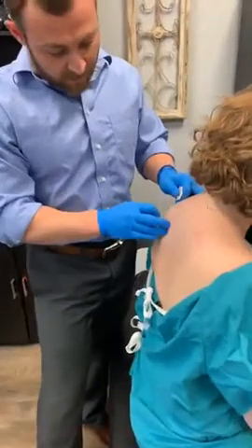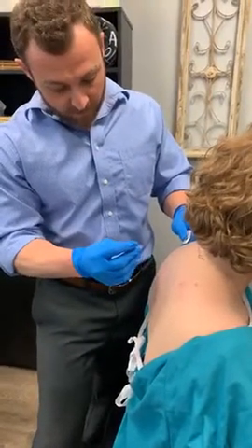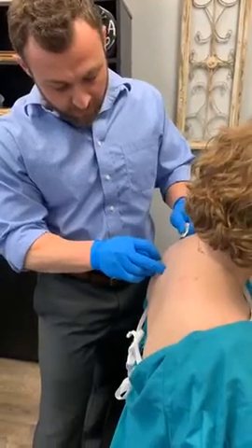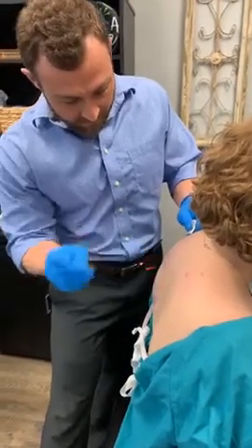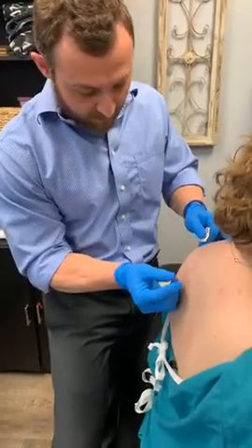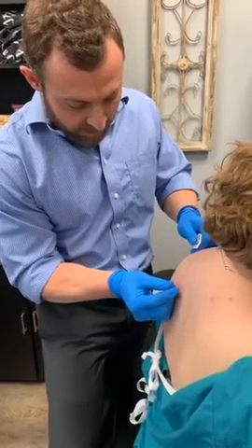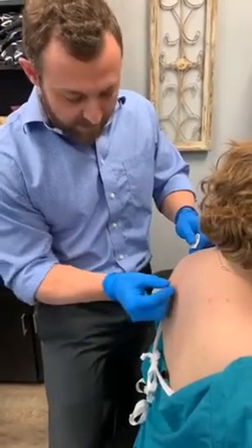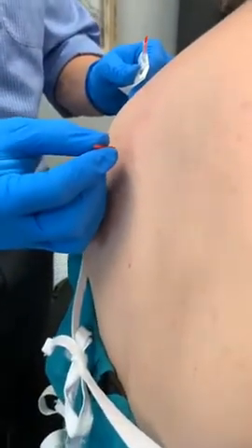So here we're just going to go right in this area through here. This is her left shoulder blade, so we've located a few basic knots here. And this is a fairly painless procedure. The main risk with dry needling is there could be a little prick on contact, but hardly any, because the needle is so thin. Can you even feel this, Lindsay? No. So she can't even feel this.